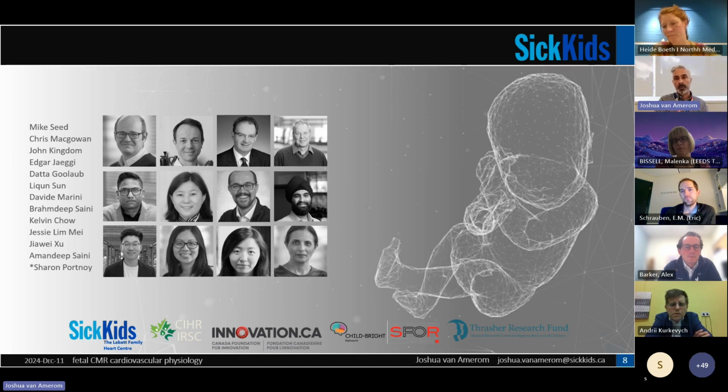We have done some work here, and I think Eric was involved in this as well, where at one point we looked at doing 2D phase contrast measurements and then using a slice-to-volume type framework to put them back together. That remains appealing in terms of leveraging a bit of the best of both worlds potentially, but with huge computational complexity. So that's a bit of a trade-off. Yeah.